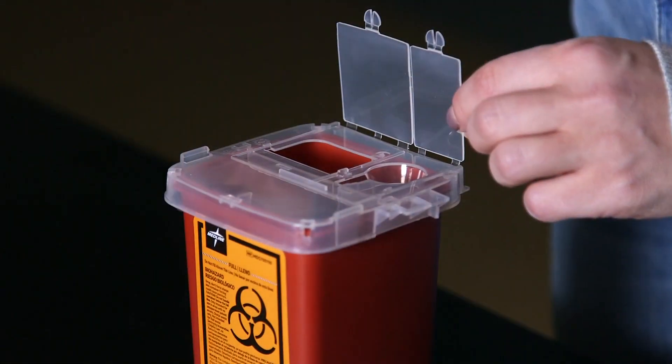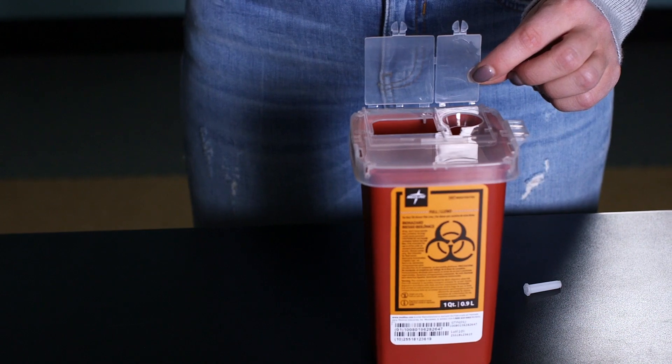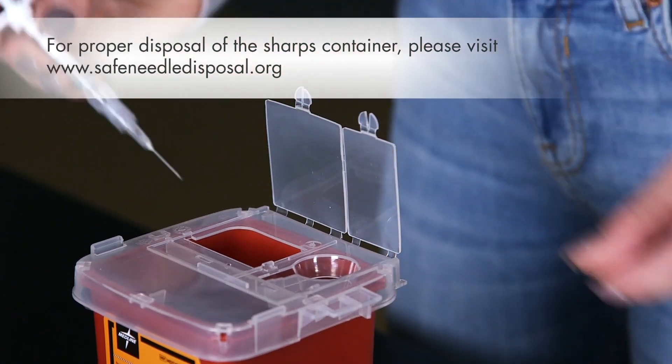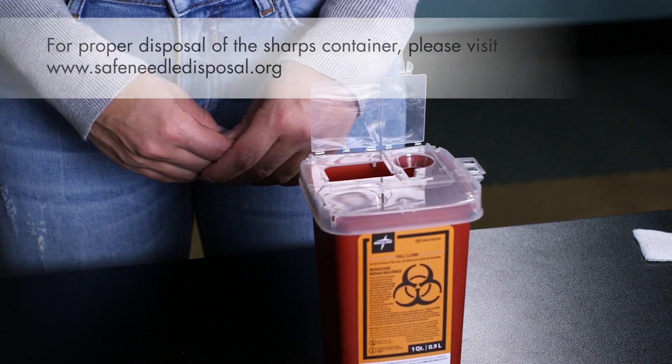The sharps container comes with a permanently sealable top. Open the lid. Without recapping the needle, dispose the cap and the needle into the sharps container. You can close the lid, but do not seal it until it is full.